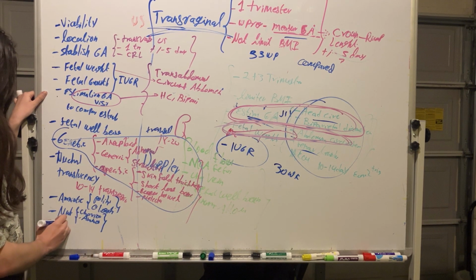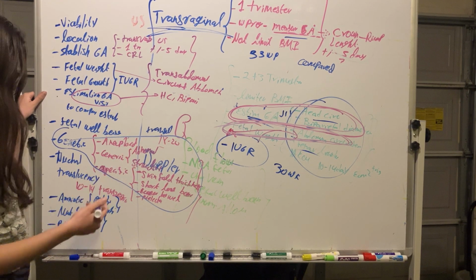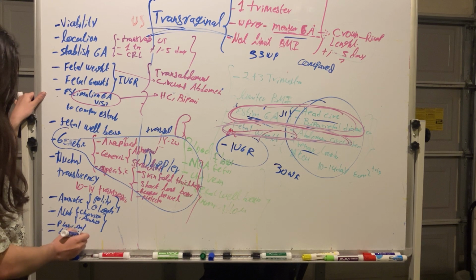And also for placental implantation, for example, if we have a low-lying placenta, so we also want to evaluate the placenta, and bleeding disorders.